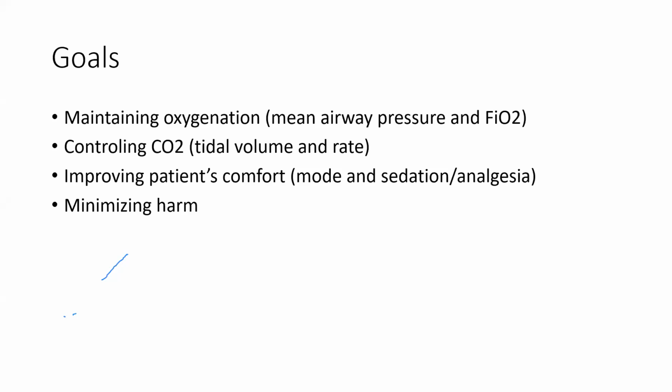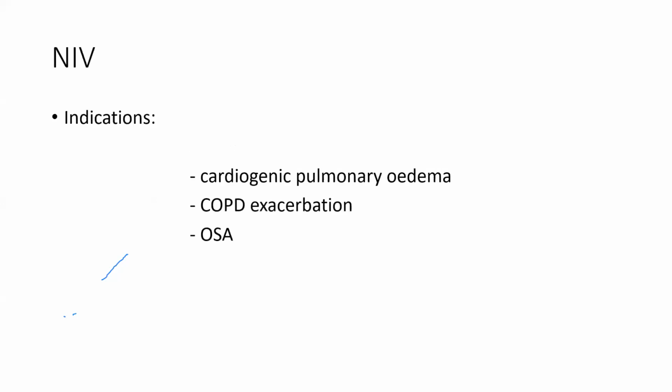If a patient has respiratory failure, for example, and you need to ventilate him, the first question is whether he is a candidate for non-invasive mechanical ventilation, or you will go directly to invasive mechanical ventilation. As we said, invasiveness is one thing you want to minimize, and non-invasive is always preferable if it is suitable. The problem with non-invasive is that it is not suitable for most critically ill patients, and we will in a minute show why.